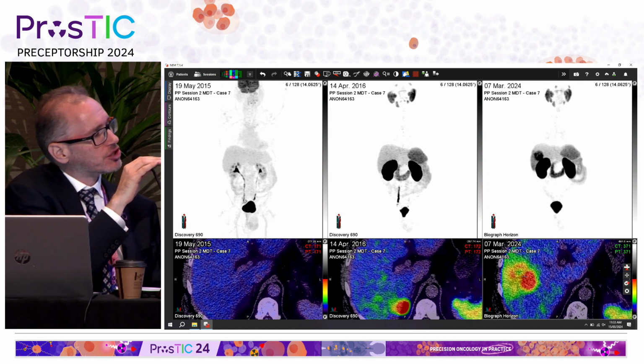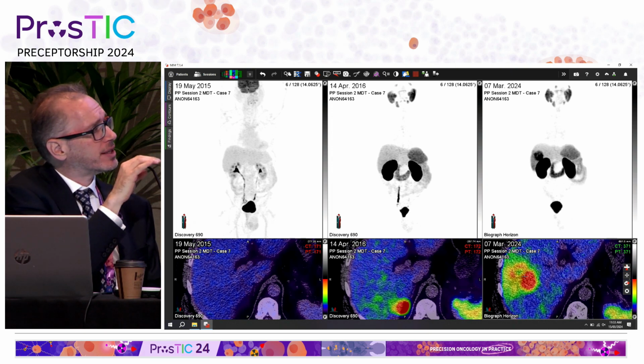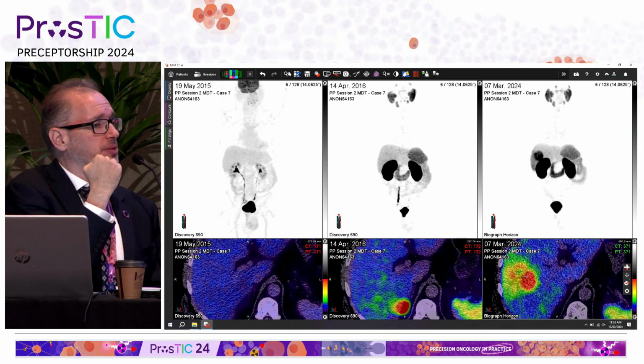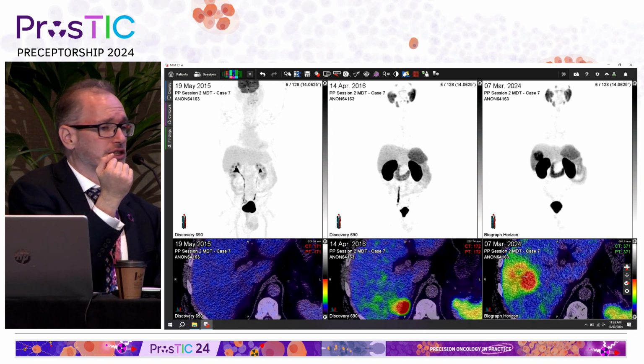I think Louise's suggestion of a hydatid cyst is also good. This is not going to be prostate cancer, but the FDG PET doesn't show a primary elsewhere, like a colorectal primary, so it's a bit of a mystery. I would do a CEA, I would do an alpha-fetoprotein, hydatid serology, and probably a biopsy.